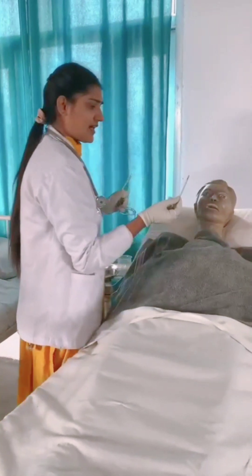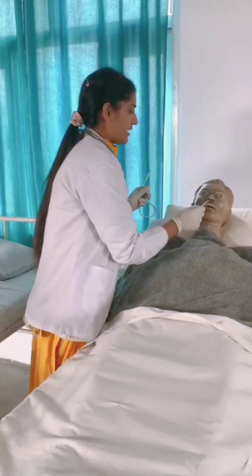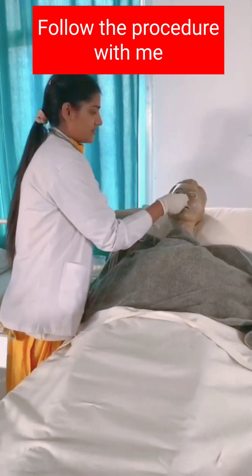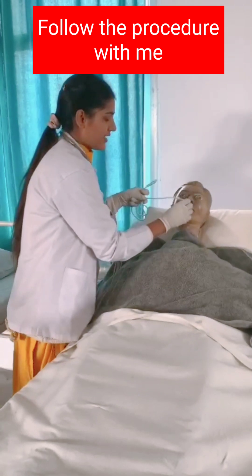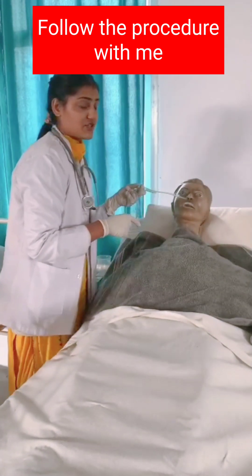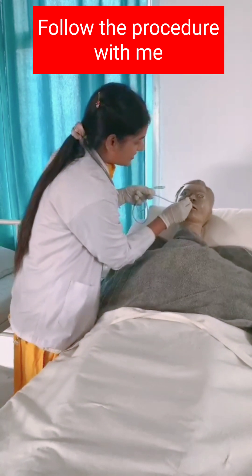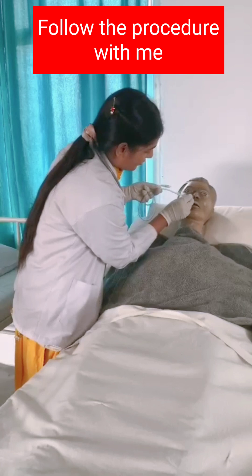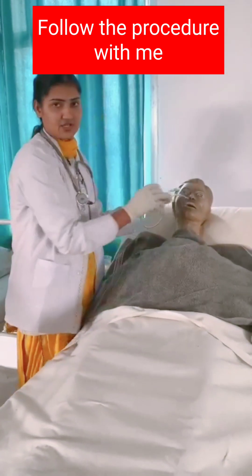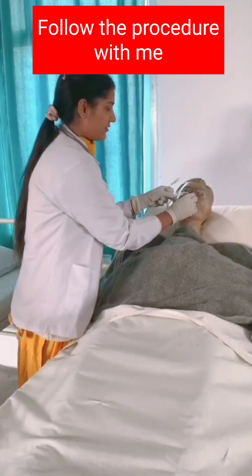Then I can administer the tube into any nostril of the patient. After lubricating, I will insert the nasogastric tube slowly and I can also ask the patient to open their mouth so I can see if the nasogastric tube is going correctly or not. Once the tube reaches the marked length I measured, I insert up to that mark.